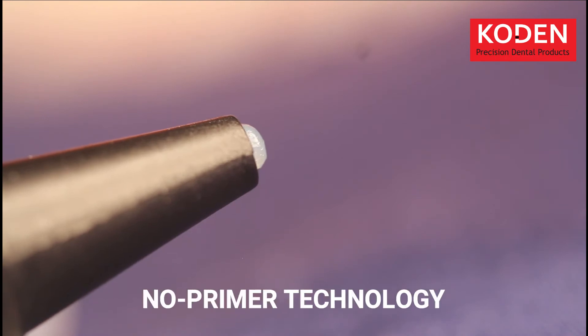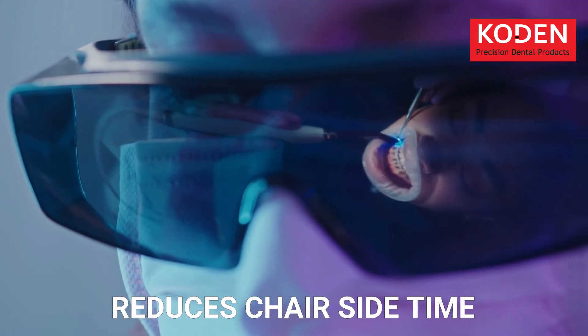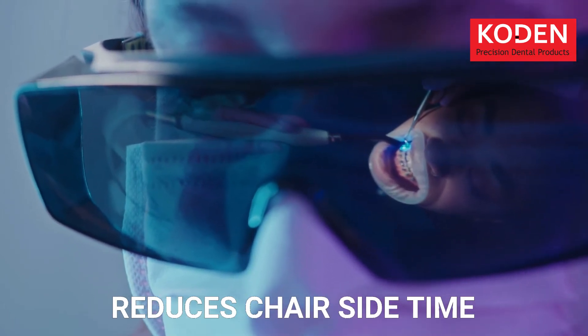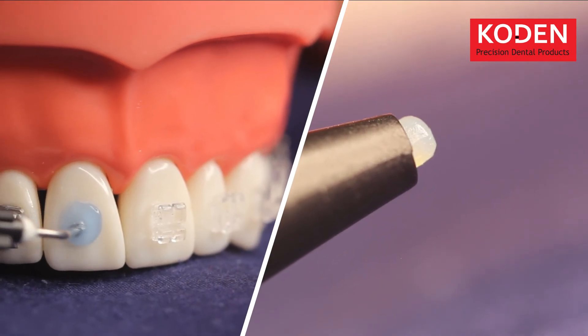Easy Bond comes with two-pack, no-primer technology. It is one of the first products in the country designed to reduce chairside time and improve operator feasibility. Just etch and bond — you're good to go.